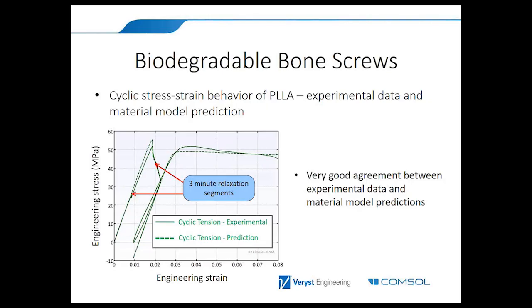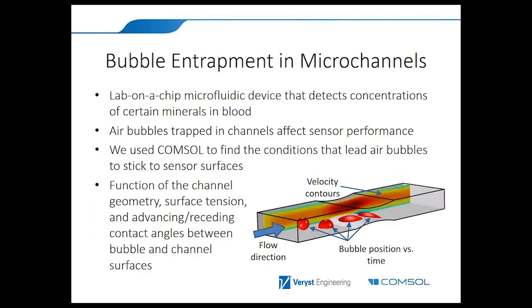And the next one is now a different example. It involves a lab-on-a-chip device that detects the concentration of certain minerals in the blood, and that device's performance suffers when air bubbles get trapped in the channel, especially where the sensors are. So this is not the real geometry. This is just a lot of modifications, but it still captures the same concept that was a problem in the real device. So we use COMSOL basically to find the conditions that lead to the air bubbles sticking to the sensor surfaces. You cannot prevent bubbles from originating in some cases, but if they don't stick, then you're good enough.